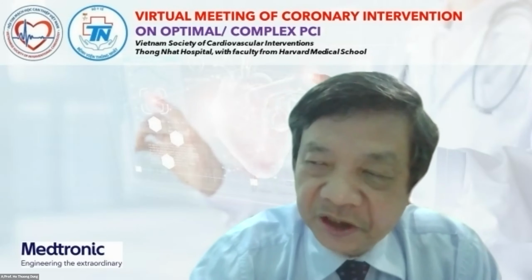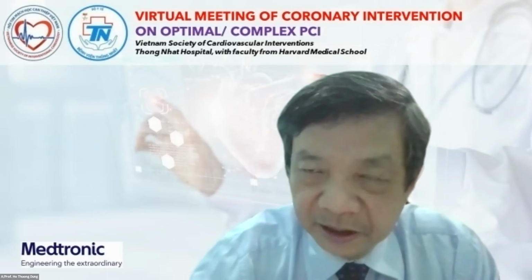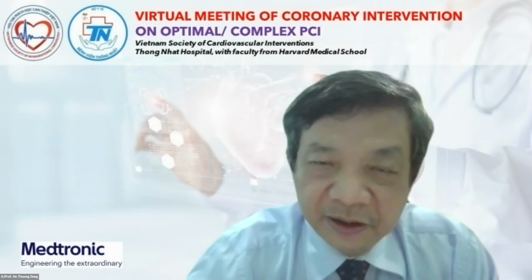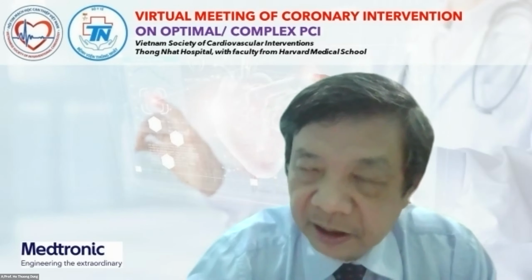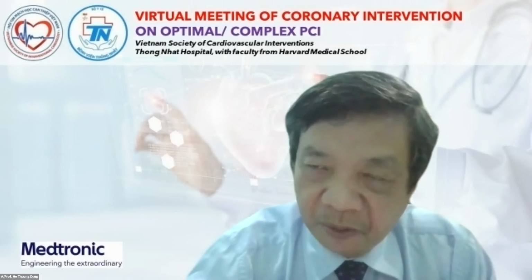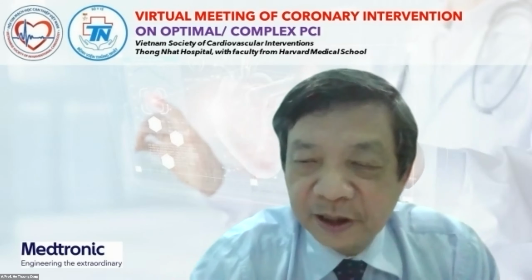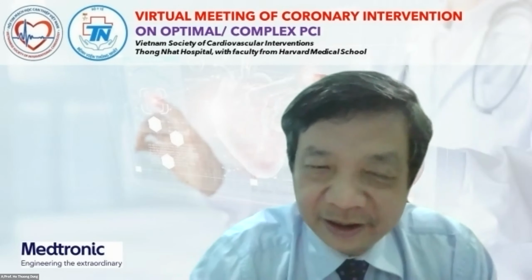And in very severe or complex PCI, severe stenosis and long diffuse lesion, to push the contrast, to evacuate the blood to record a good image, is very difficult. So in some very complex PCI cases, like my case this morning, we cannot use OCT. And in those cases, I think the IVUS is easier, because in a very severe and long diffuse lesion, it is very difficult to push contrast to evacuate blood from the vessel. So I think if we have both techniques, very excellent. But if we have only one, it's still excellent.